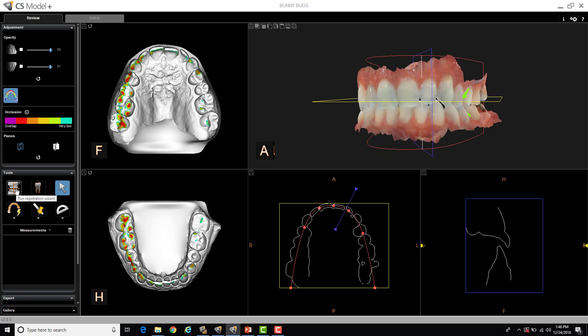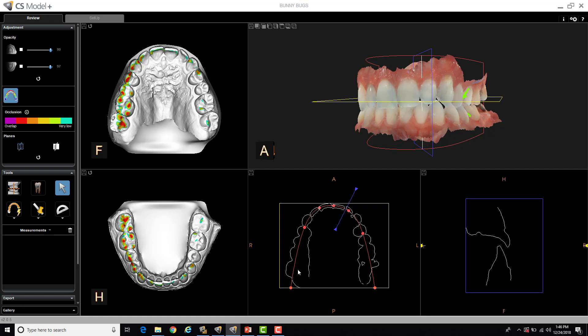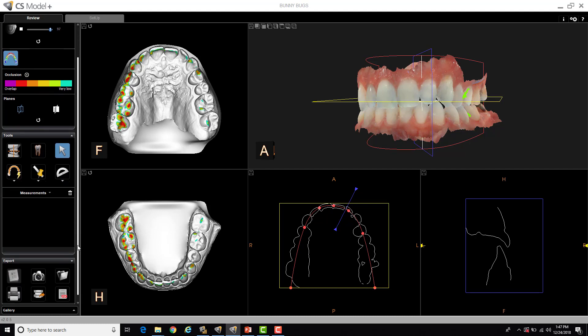So other options, I can run the registration wizard. And I've actually covered this in a different video. I'm not going to cover that right now. Run segmentation. This is for CS Model Plus, which I'm not going to cover now as well. This is create an arch, which is what we're seeing here. It does do a nice job automatically. We generally don't have to redo it. But if you wanted to redo it, you can select this. It will delete it. And then you just mark your points here. And here's where you can actually create and it measures angles from three points. I'm not going to go in depth on those features right there.